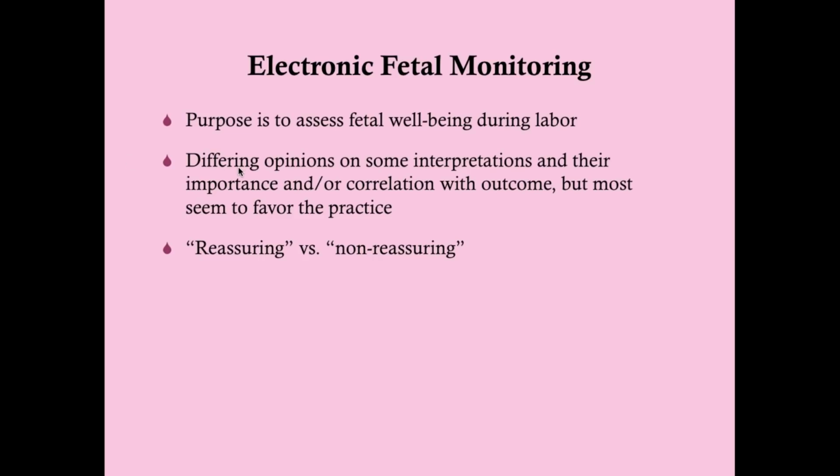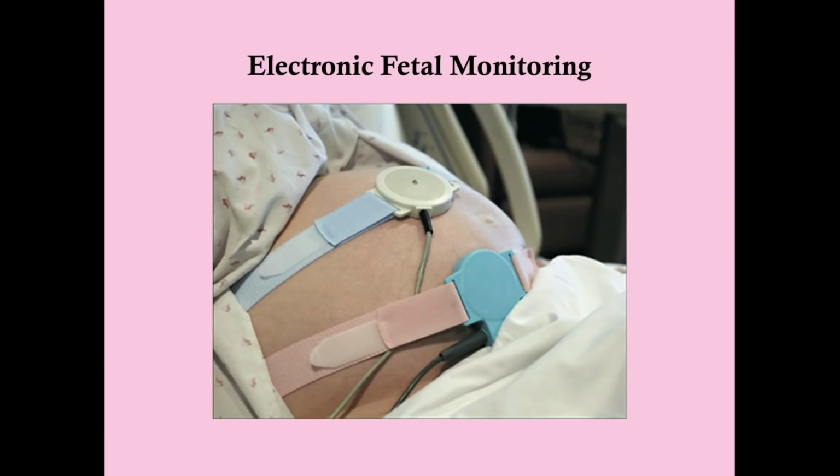So there are some differing opinions on some of the interpretations that we're going to see here and their importance or correlation with the outcome, just because we have such a high false positive rate. However, most seem to favor the practice of routine electronic fetal monitoring. It's very commonly done in this country.